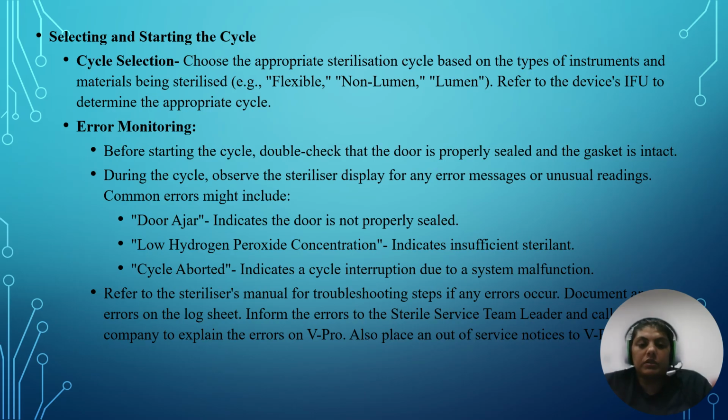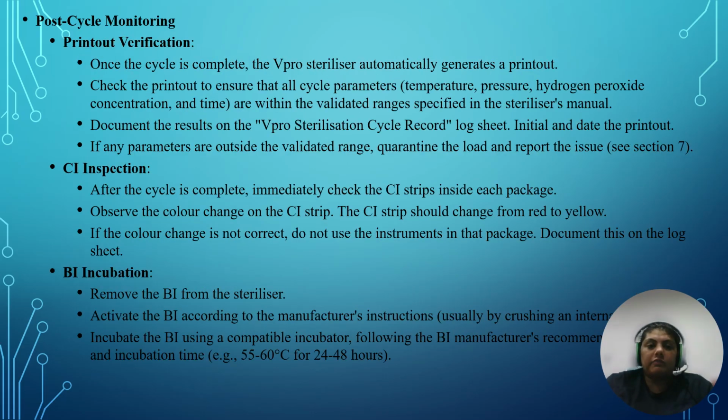Inform the error to the sterilizer team leader and call the company to explain the error on the VPRO. Also place an out of service indication. If it's more than one working day, log the job on the Safe Hub.